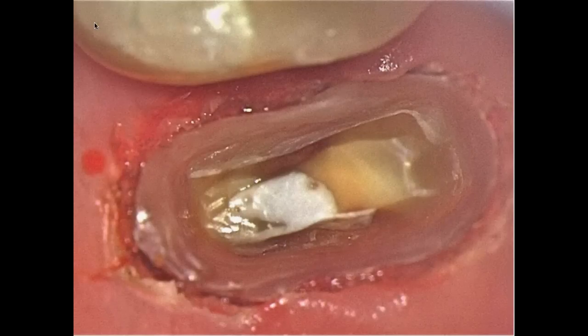The next question: is it possible or is it hard to work with the microscope in a higher magnification and at the same time use instruments without looking away from the microscope? Yes, it's not a problem at all. The magnification doesn't influence the use of your instruments. Of course, at very high magnification, it might be difficult to keep your mirror quiet, for example, because you can see every beat of your heart in the mirror. It's shaking at every heartbeat. But except for that, it's not difficult.